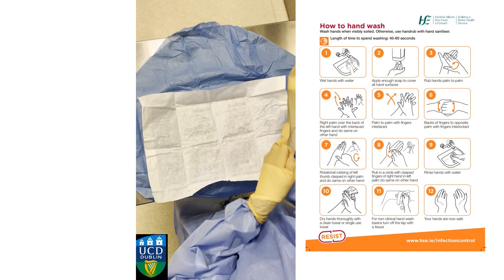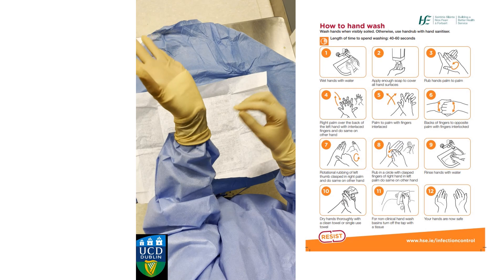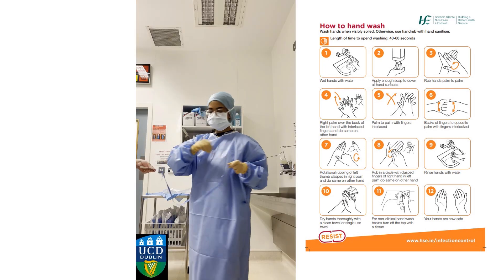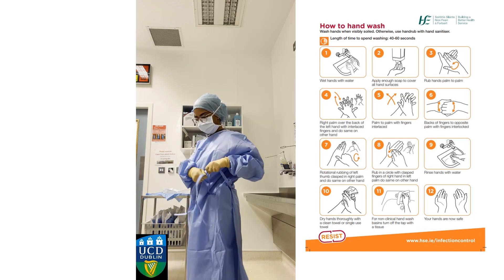Hold out the ends of the gloves on the other side. If your fingers end up in the wrong part, you can simply fix it like so. Tie up the gown — remove the short end of the card. Hold one end of the card while your assistant holds the other end. Spin around and tie up the gown.